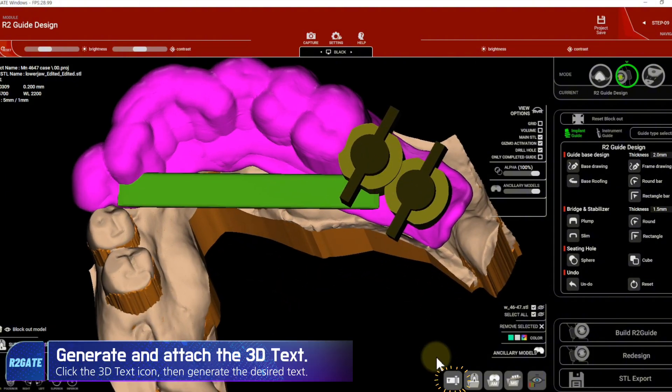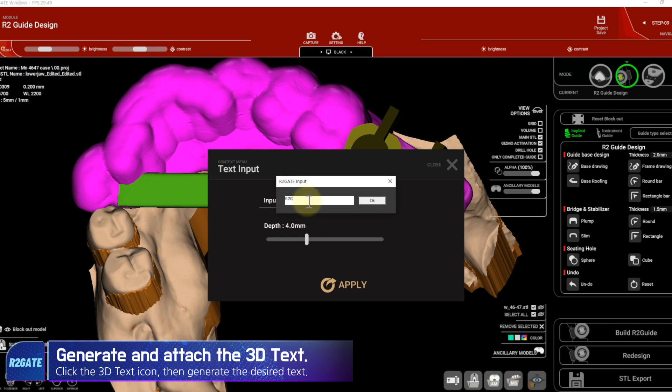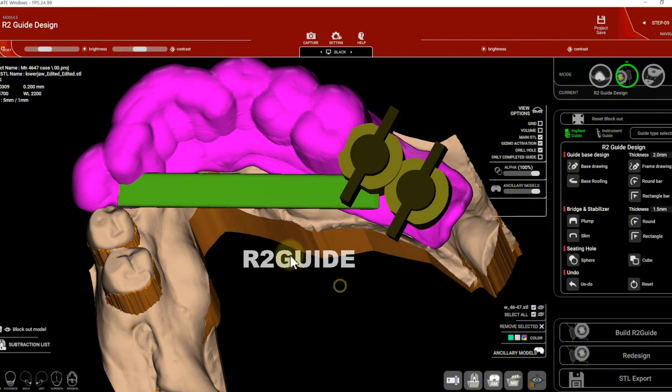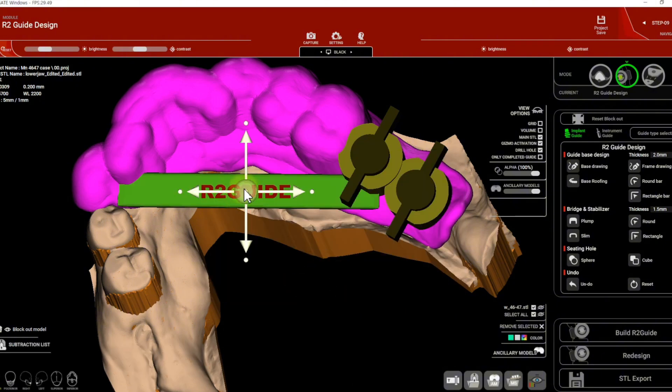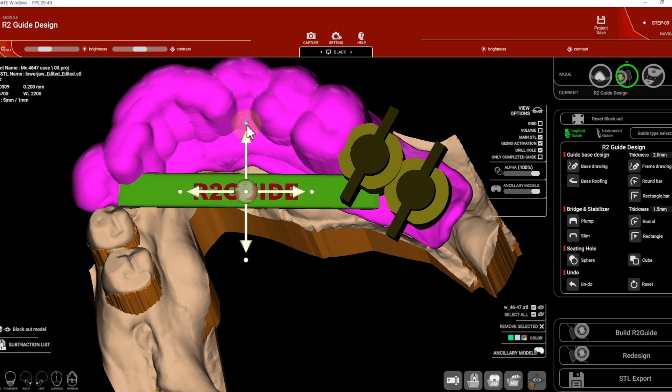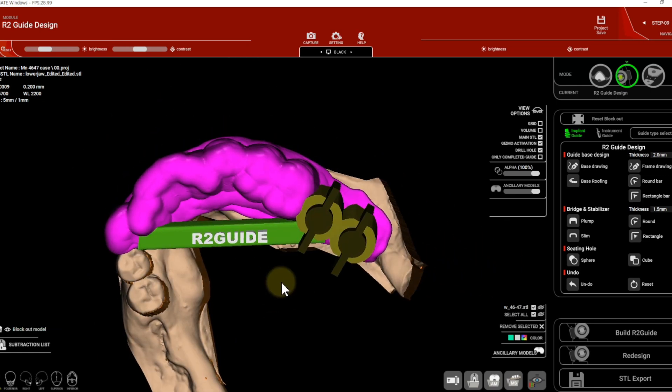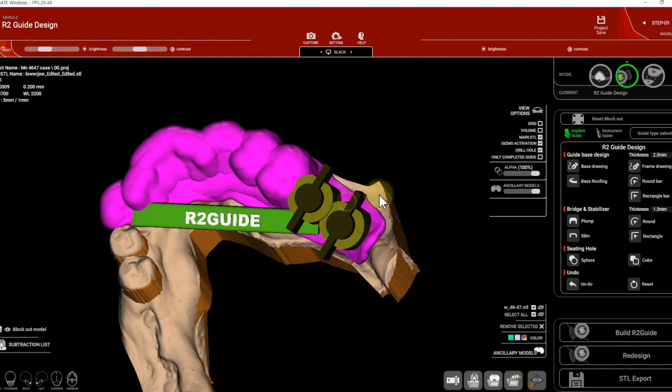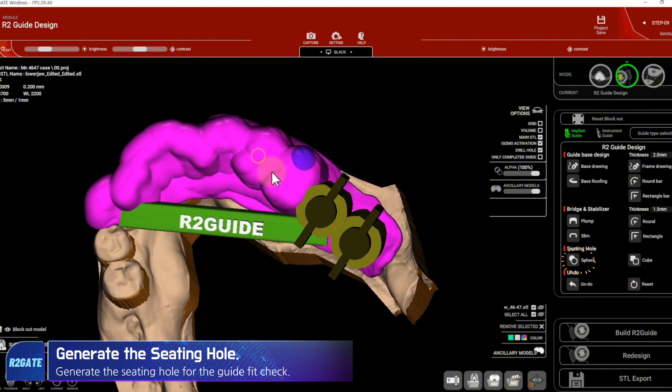Click the 3D text icon, then generate the desired text. Select the seat hole for the guide fit check.